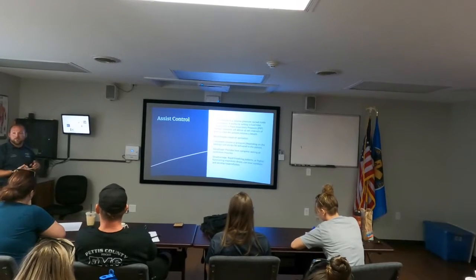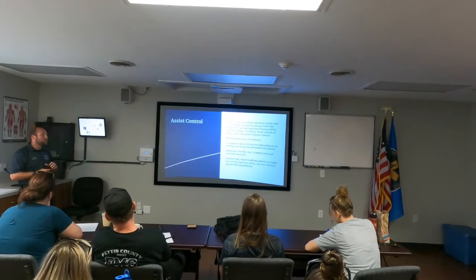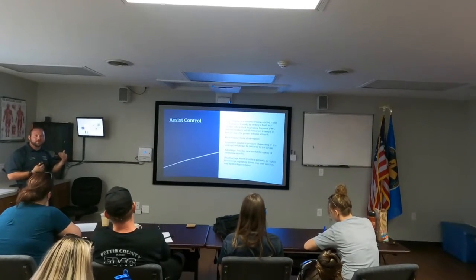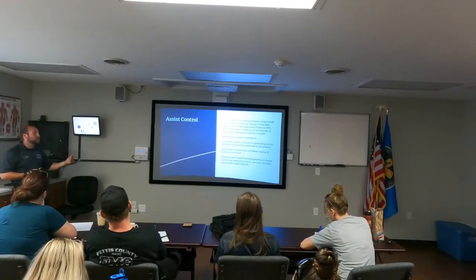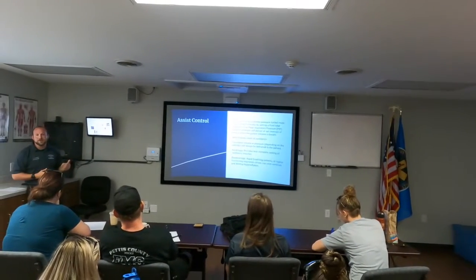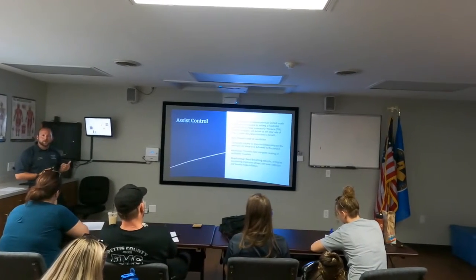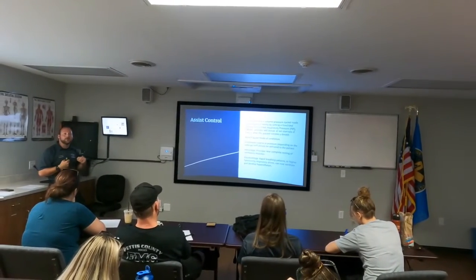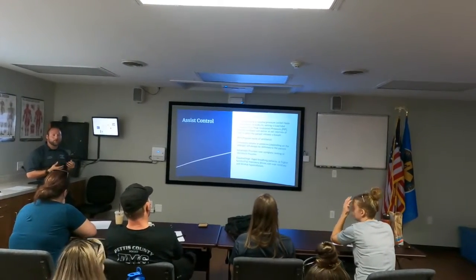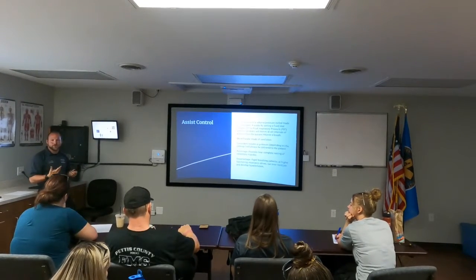Disadvantages: if they're not properly sedated or properly paralyzed, or they have a higher respiratory drive than you're anticipating, you're going to run into issues of overventilating, developing hyperinflation and barotrauma. That patient's going to get tired very quickly. They will be bucking that tube. They are going to have auto-PEEP and breath stacking, causing further problems that we are trying to avoid.